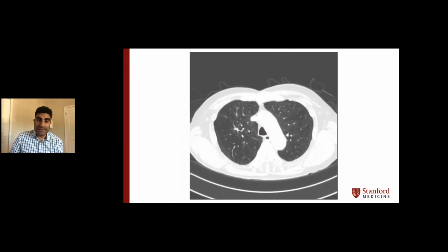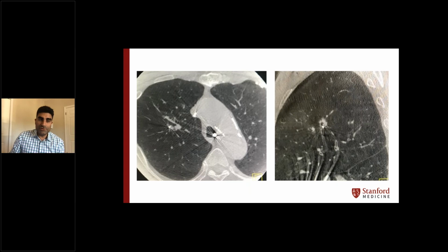Now I'm just going to talk about a couple of cases here. You can see this is a quite challenging small target, about 7 to 8 millimeters, in the right upper lobe, a spiculated nodule with some ground glass surrounding it. Here's a case where our needle's going into it, and we were able to diagnose an adenocarcinoma with that. This is a case that honestly, I think many people with superDimension would have passed up on, or if they went after it, they just wouldn't have successfully diagnosed it.